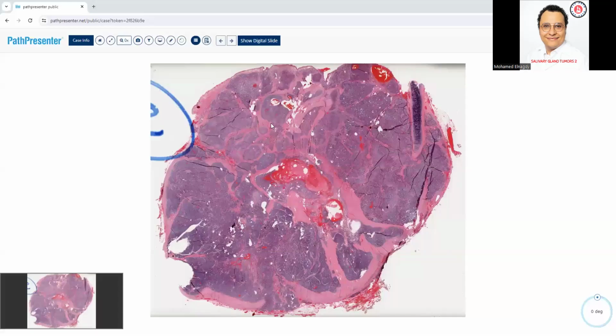Okay, so who's next? Next is Muhammad. Ready? Okay. Oh boy. Oh my goodness. Yeah, the slide I think is even marked.